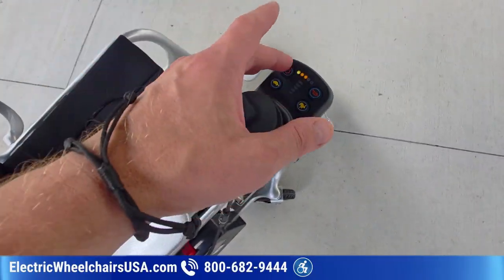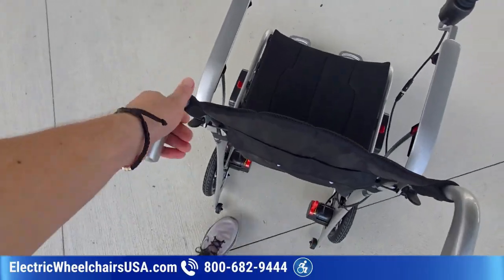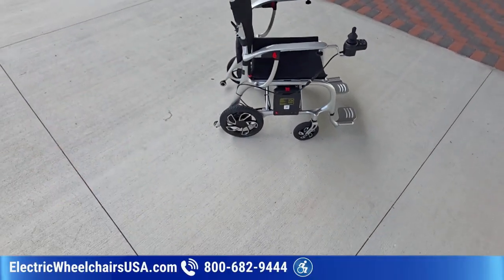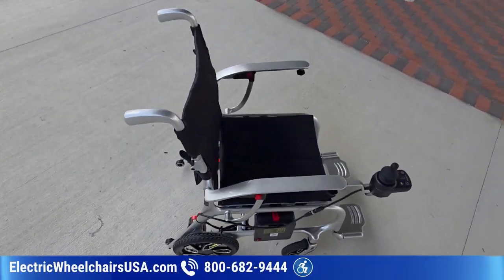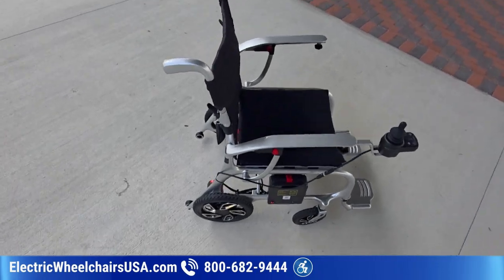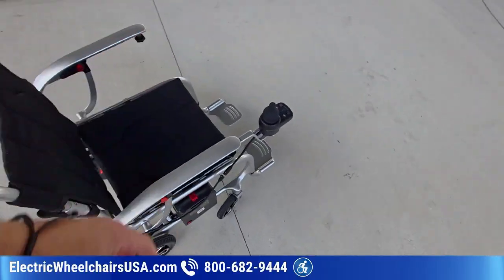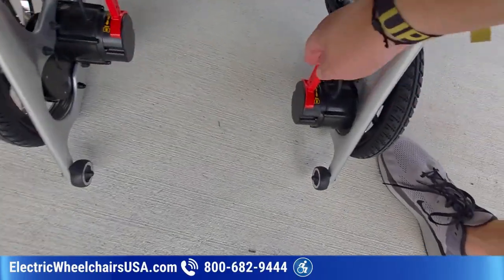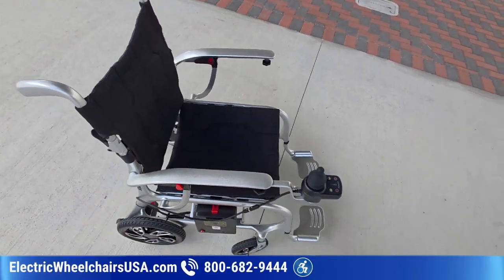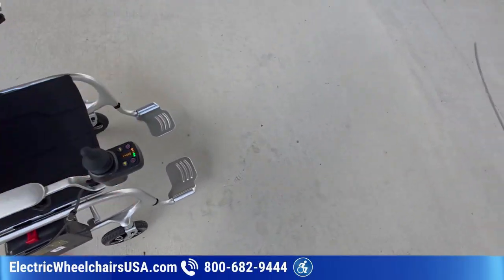Now, if you want to push it and have no tension, you have to turn it off when both of these levers are in freewheel, and now you can push it like a manual wheelchair. So great for a caretaker, or if you just wanted to get up and walk around, use it as a walker, just kind of stretch your legs a little bit. You can do that too. You can push it with both of the levers in freewheel on the motors, and if you keep the joystick on, you can push it, but there's a lot of tension. So to relieve that tension, you have to turn off the joystick. Now I'll put these back into the drive position and power it on. And now you can use the chair.